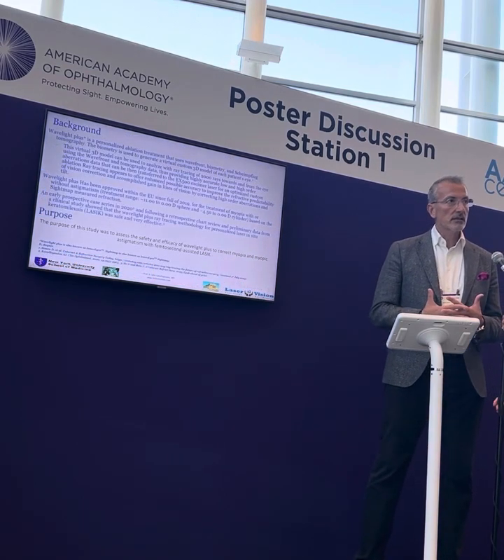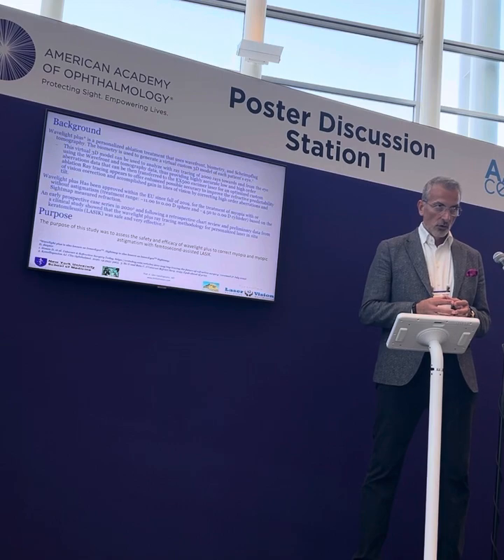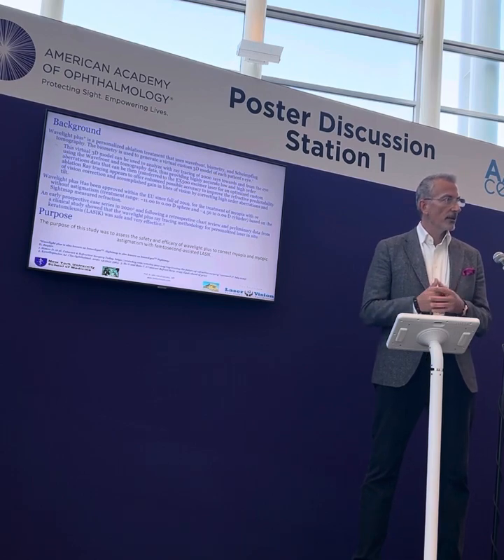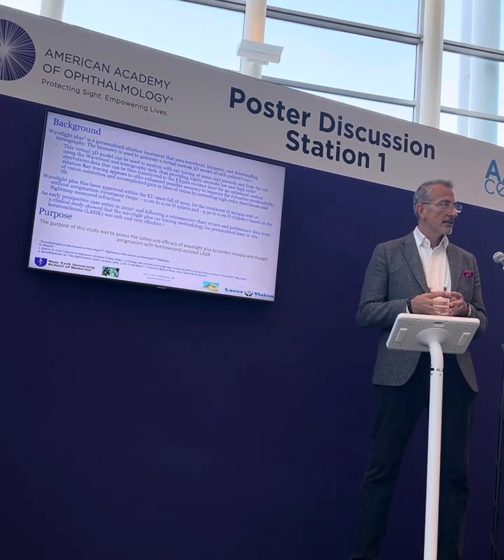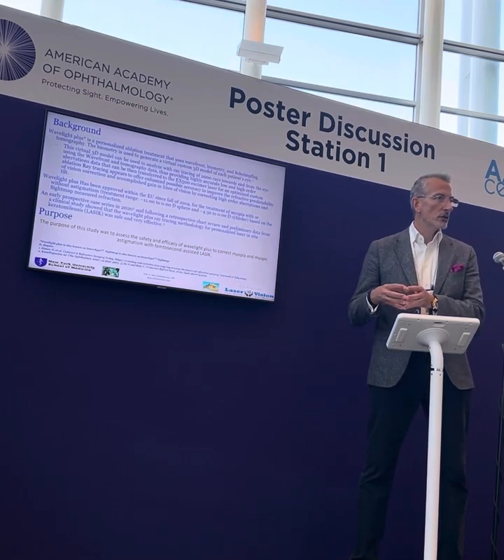So Wavelight Plus is a commercial name for this customized technology that uses ray tracing in order to determine automatically lower aberrations, myopia and astigmatism, because this was a myopic astigmatic LASIK study, as well as high order aberrations. It is a completely different refractive surgery entity than what you have been used to till now.